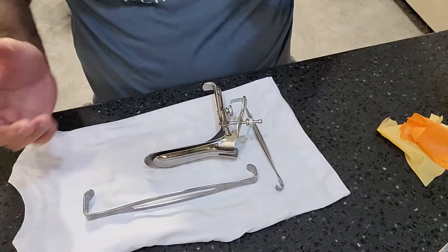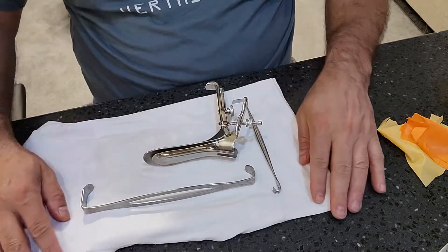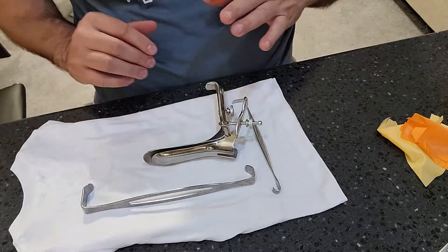Welcome back to WDYDCSP — What Do You Do as a Central Sterile Processor. I'm Jesse Lopez, and as promised I'm continuing this series on how to inspect basic instruments. This video is all about inspecting retractors.